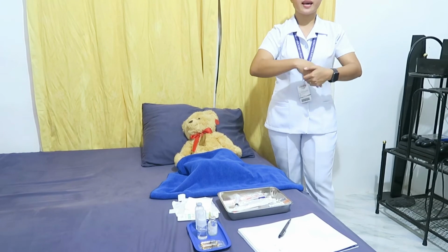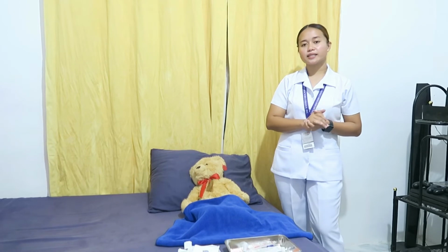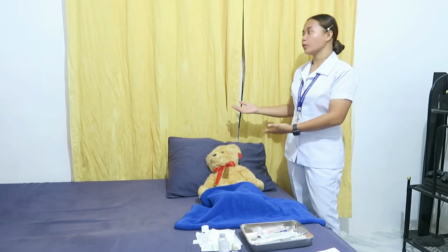And then, next is to prepare the medication from the ampule or vial for the drug withdrawal. This is because sterile items that are out of sight are in danger of being contaminated accidentally. Then, after that, provide the client privacy. This is to lessen patient anxiety. So, as you can see, I've already closed the window, also the curtains, and also the doors.